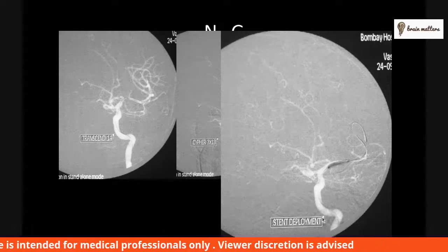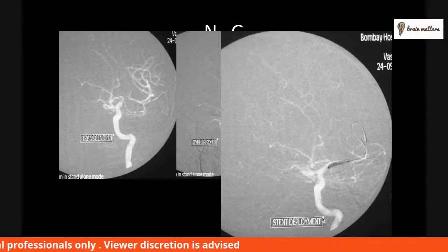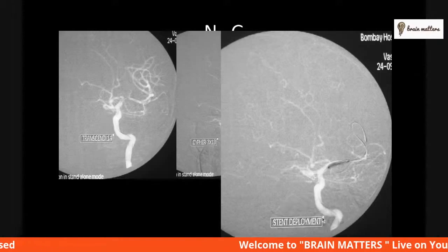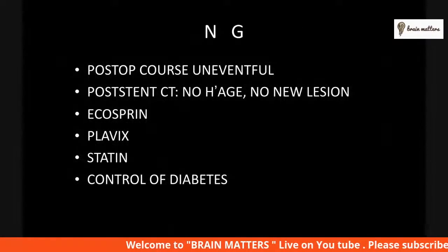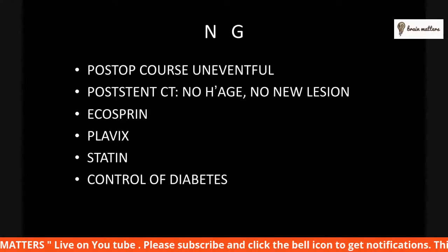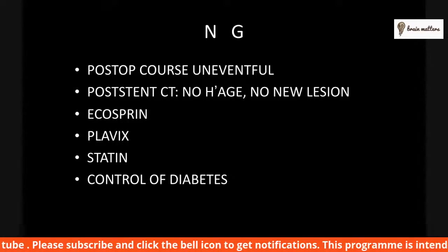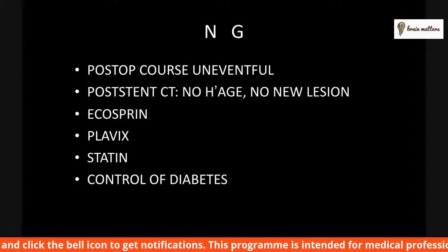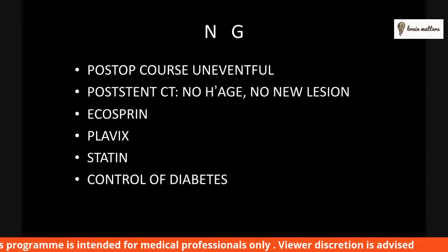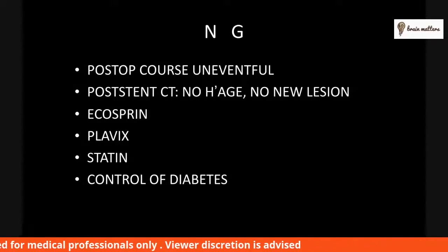As you can see, we've got a perfect position. Again, unfortunately, I do not have his post-stenting pictures, but you'll have to take my word for it that this was a perfect result. So the post-operative course was uneventful. And in fact, I think in 2002 we had done him. And later, about 5 years later, he came back with Parkinsonism. And then he went for physiotherapy to Iyengar.